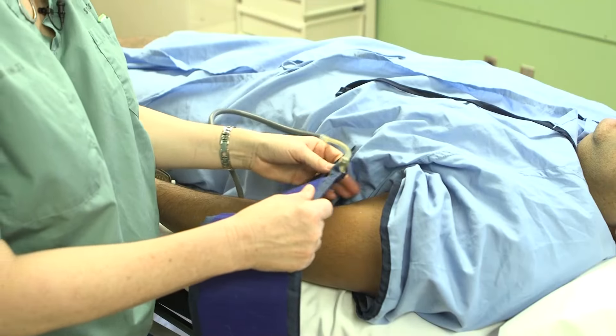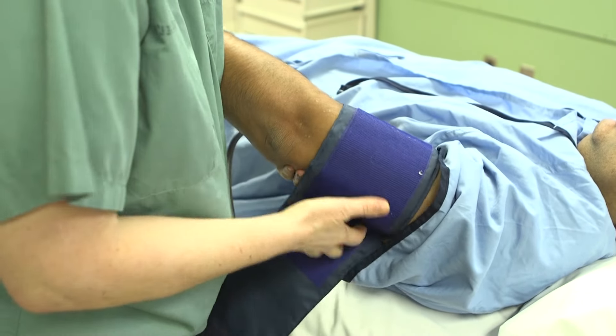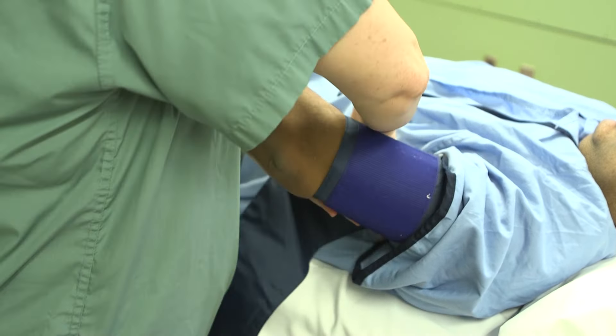You apply the blood pressure cuff to the patient's arm, taking care that you leave enough space so that you can still access your brachial artery.